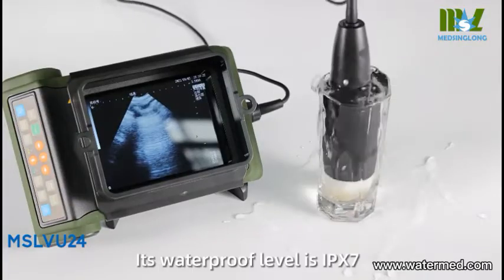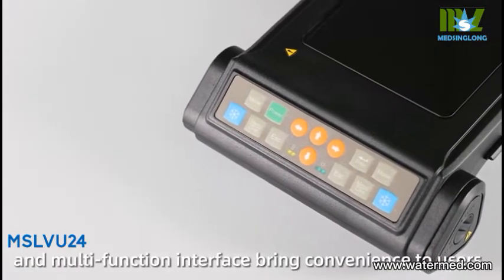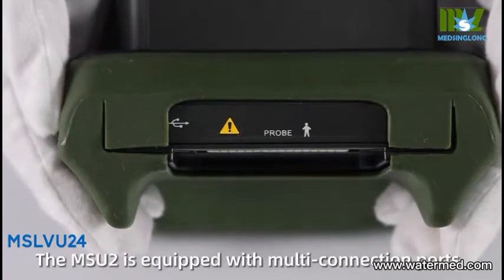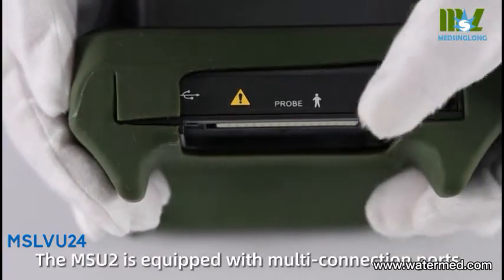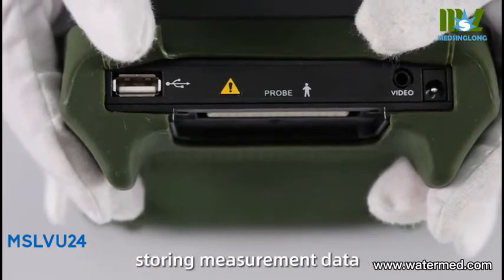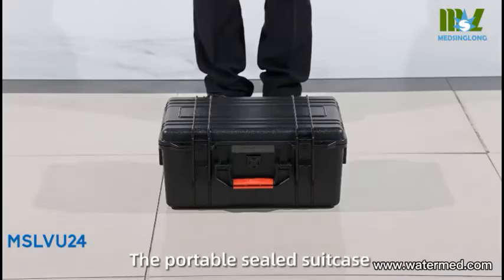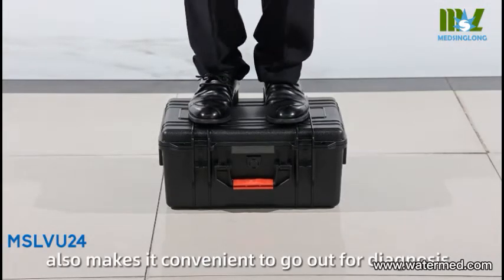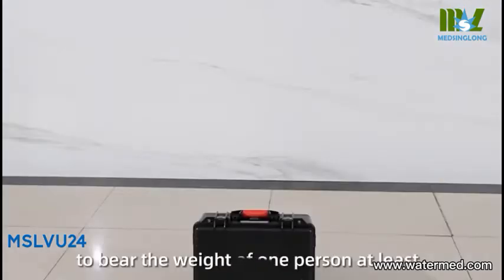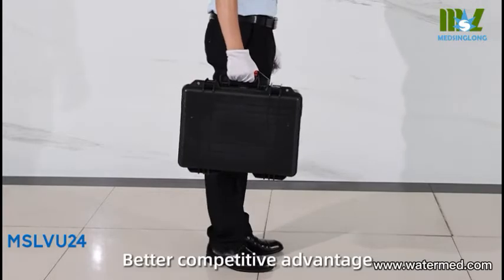Its waterproof level is IPX7. The comfortable keyboard design and multi-function interface bring convenience to users. The MSU2 is equipped with multi-connection ports, satisfying convenience for charging, storing measurement data, and connecting video glasses. The portable sealed suitcase also makes it convenient to go out for diagnosis. It is rugged and durable, able to bear the weight of at least one person, offering a better competitive advantage.